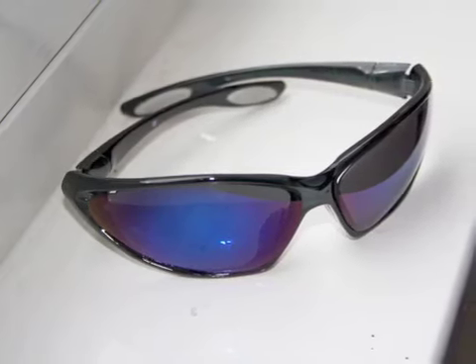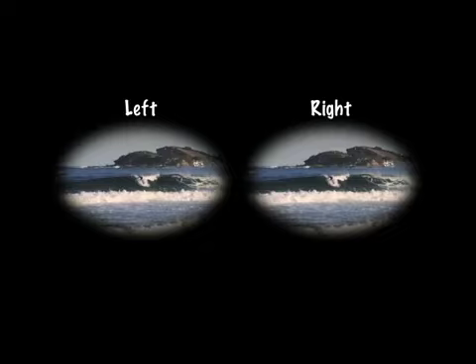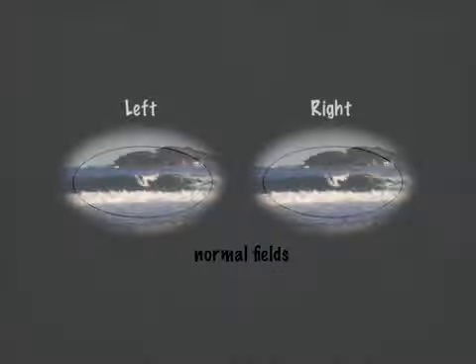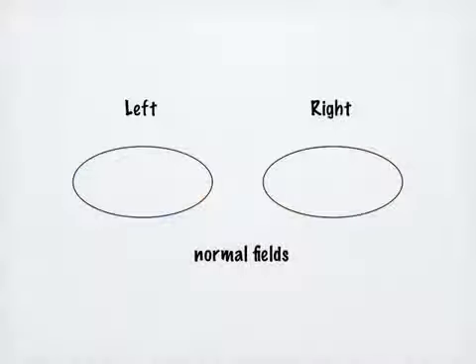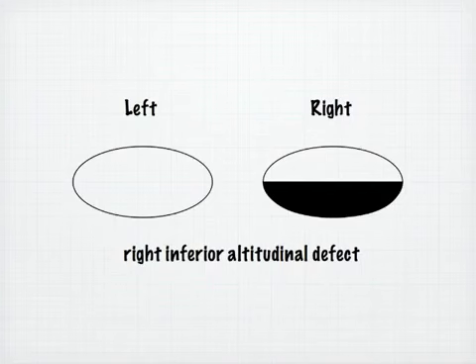The shape of the field of each eye is rather like the shape of a pair of sunglasses. For simplicity, the field of each eye can be documented as an oval shape, with the visual field of the right eye drawn on the right side of the page and the left eye on the left side. This is as if the patient is looking out through the page you have in front of you. For example, a patient who could not see below the horizon from his right eye would be documented like this, with a dark area representing the area the patient is unable to see.